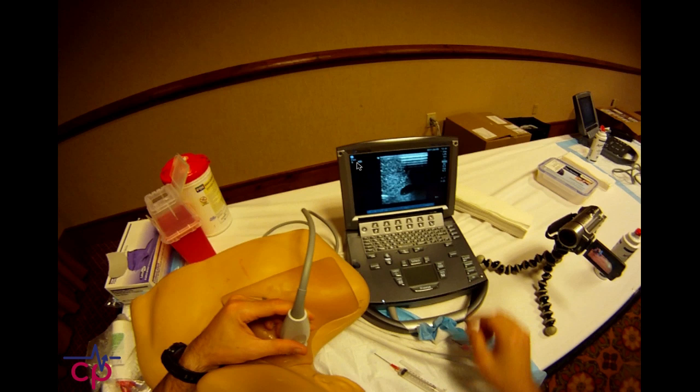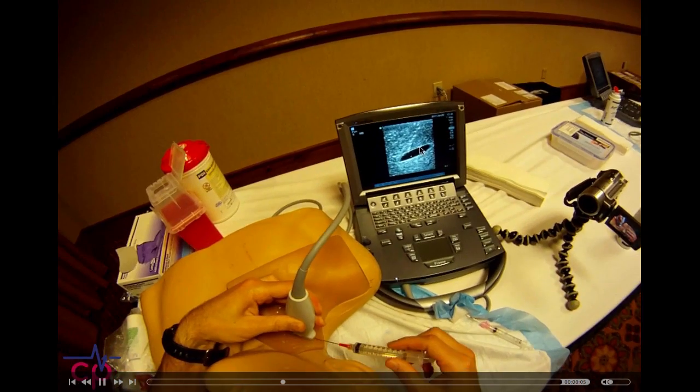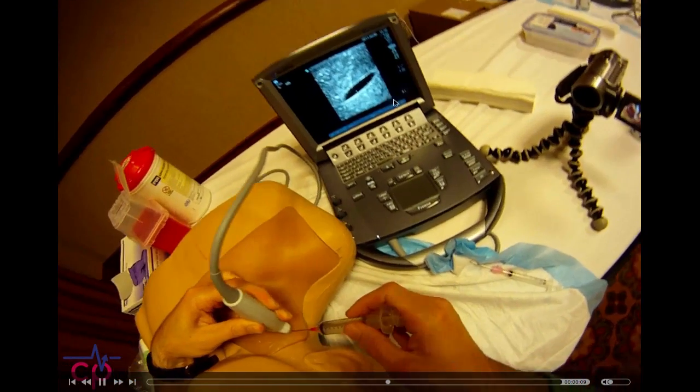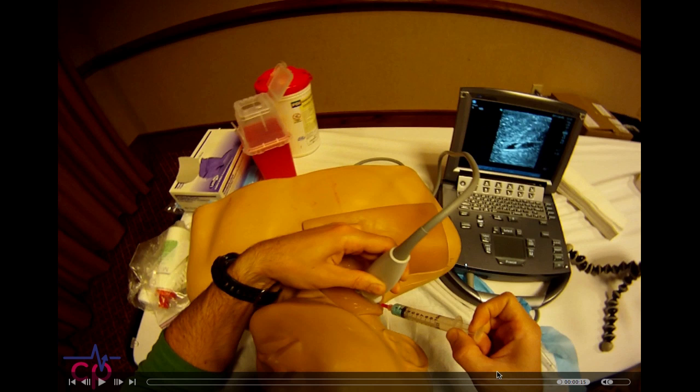Here's a version of me doing it with a helmet cam on. You rotate your probe 45 degrees — we see on the screen that we get this oblique view of the vessel. We come in in-plane, make sure we're right in the center of the probe, and then we can visualize that needle going right into the vessel. Boom — we got our blue stuff. How satisfying is that? Then we drop the probe and pass our wire.